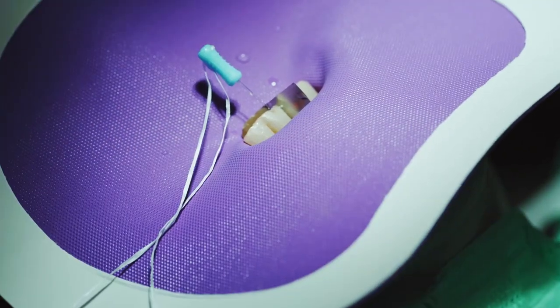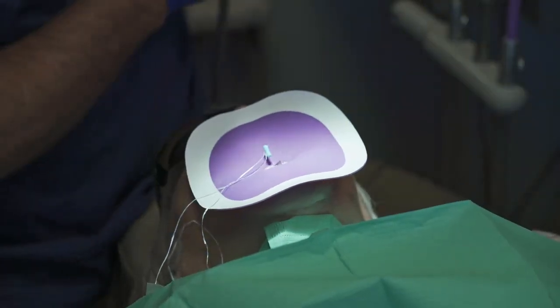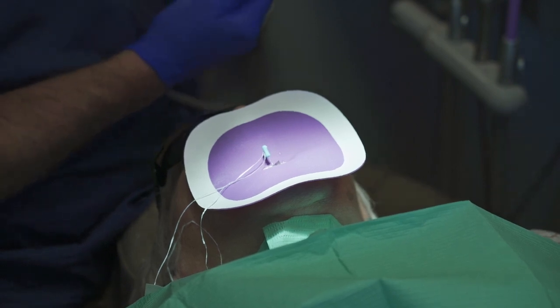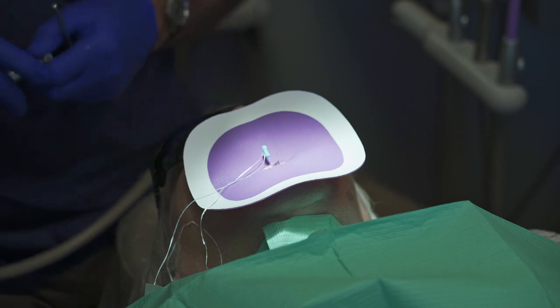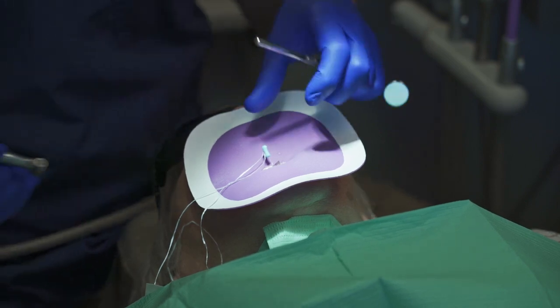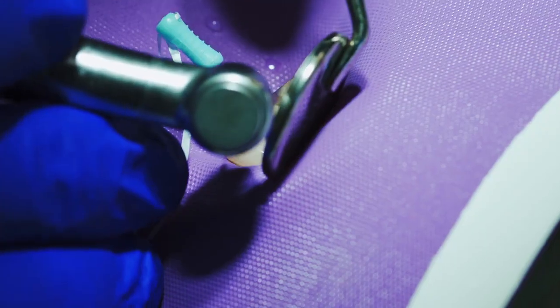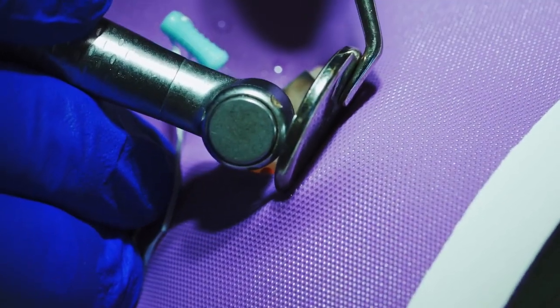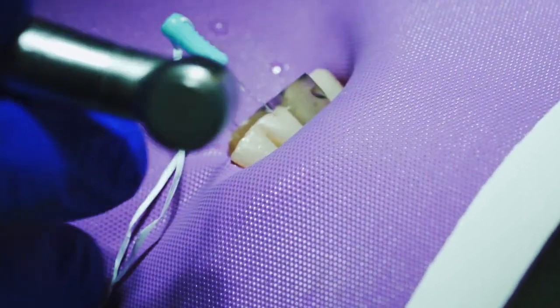Now the glass pin is inserted into the tooth. To trim the glass pin, we use the same bur that we used to make the initial hole. All that we need to do is score the edge and then it immediately removes to the proper depth that we'd like for this restoration. You just have to score it just a little bit.